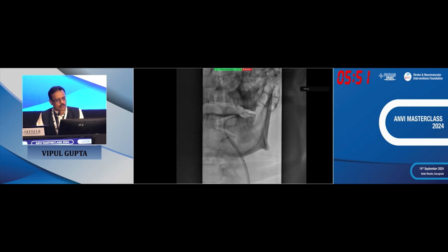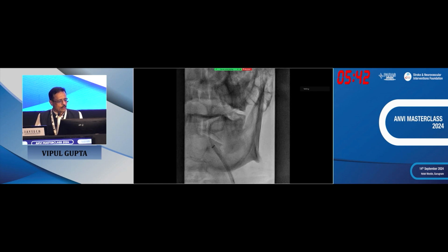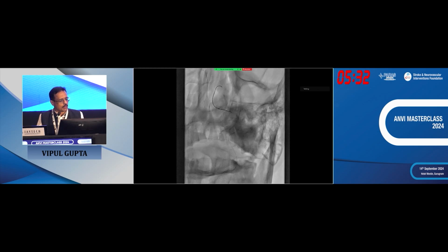Then we switched to a microcatheter with the Traxcess wire, and you can always get a feel when you reach the lumen, it became free. And we thought probably we are in the patent lumen of the artery above, and that's a microcatheter. We could track it. As you could see, most of these cases we do under local anesthesia. Vincent did mention maybe in tandems we can switch to general anesthesia as well.